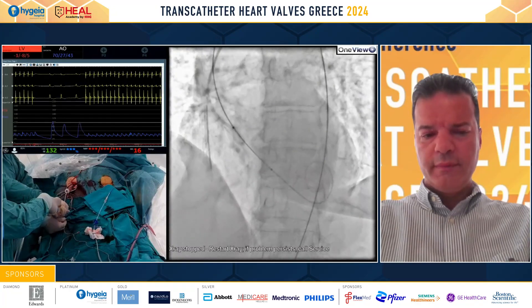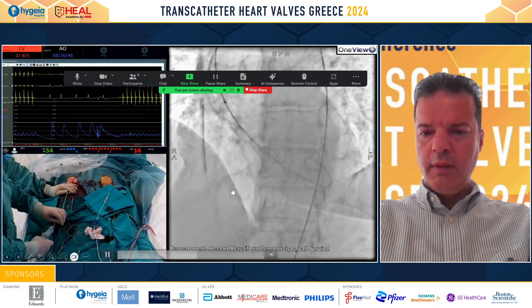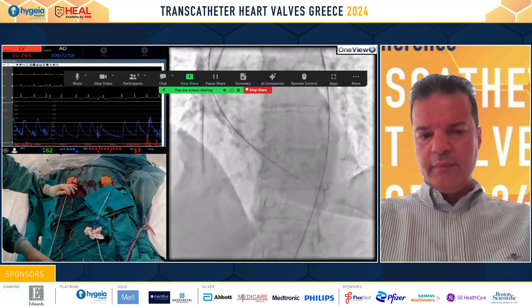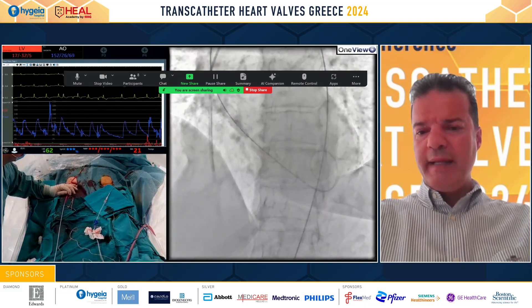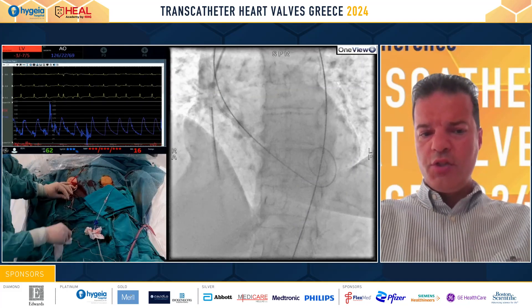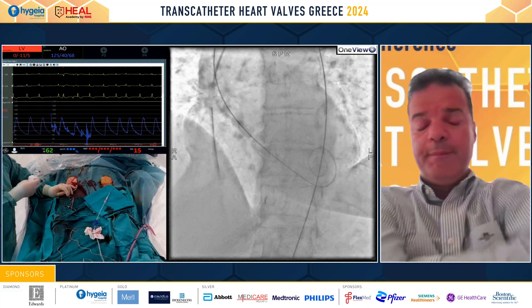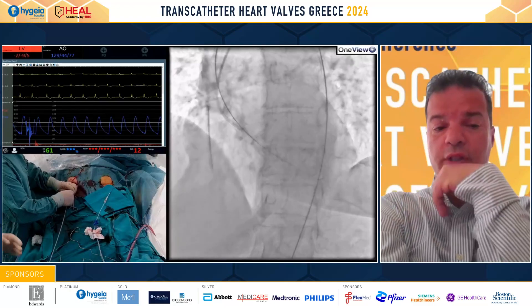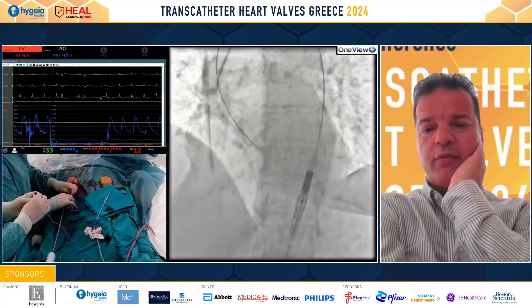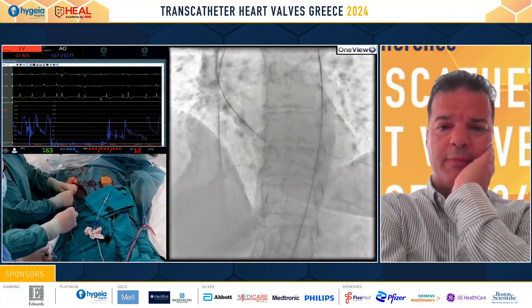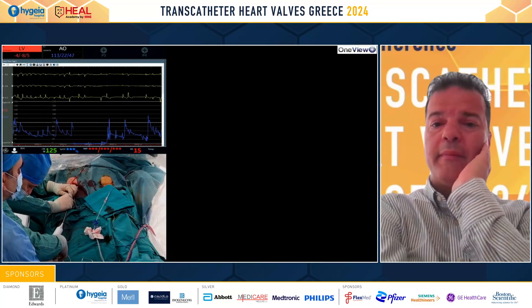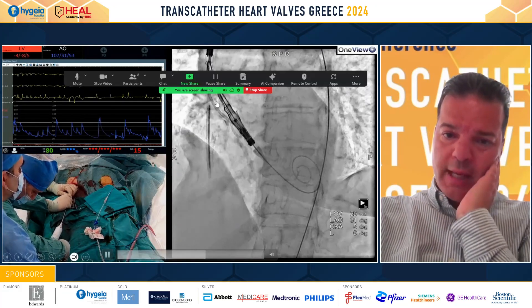Pretty straightforward. The valve is quite flexible — it follows the curvature easily without many issues. The sheath we use is 14 French and expandable, so the valve is inserted using a small insertion aid visible in my hands. It takes a little effort to expand the sheath and then it follows all the way up to the arch and down to the root. We need to ensure commissural alignment, so we look at the three posts.